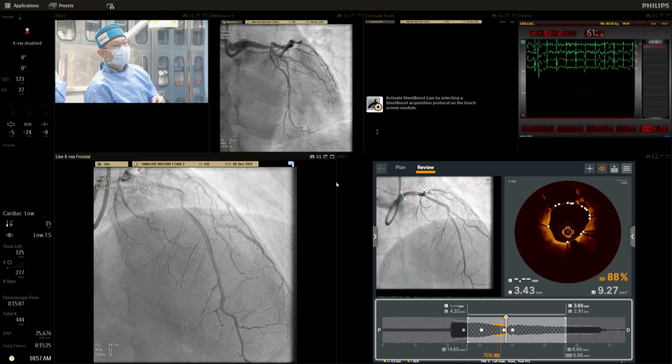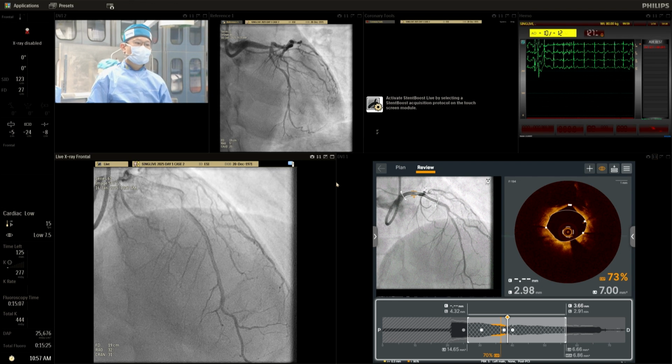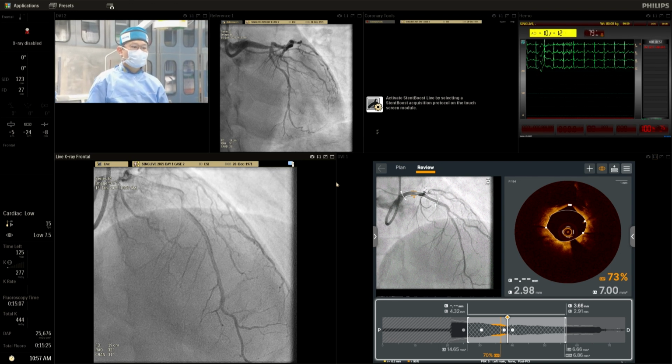I guess to comment, those are minimum numbers, and there is also the risk of achieving them. When you say OPN, I don't personally like OPN balloons, so I avoid them altogether. Because if you're trying to expand aggressively, all you get is rupture. And I think that's not really a great equation. We're trying for a few millimeters of stent area.